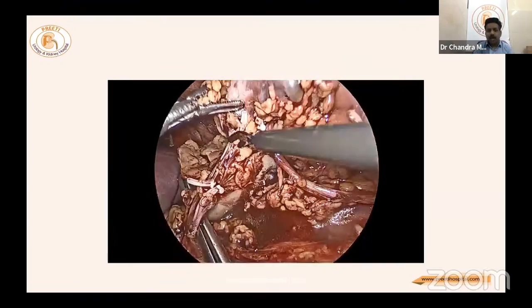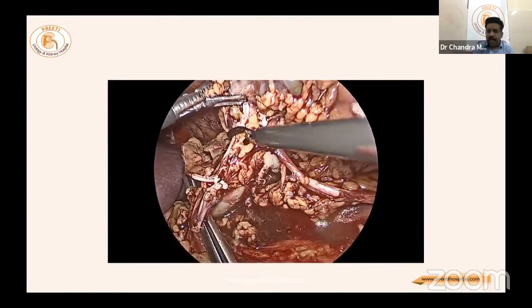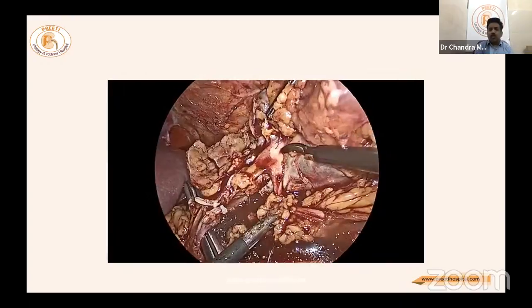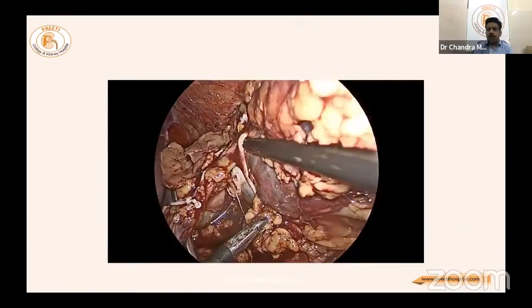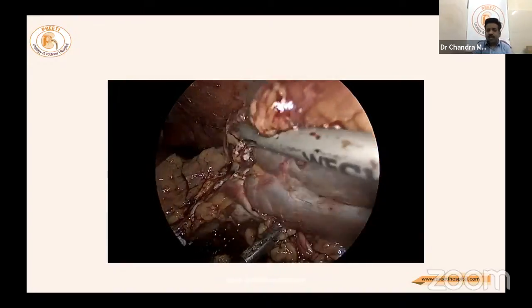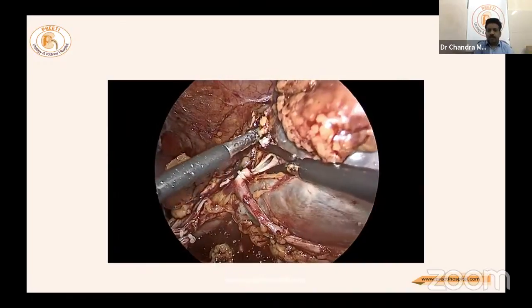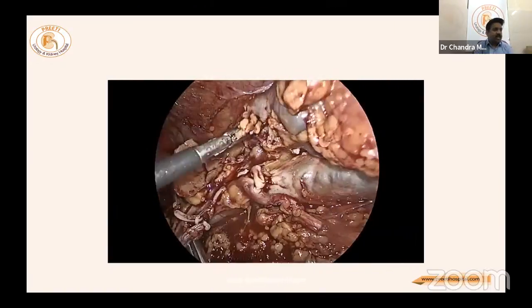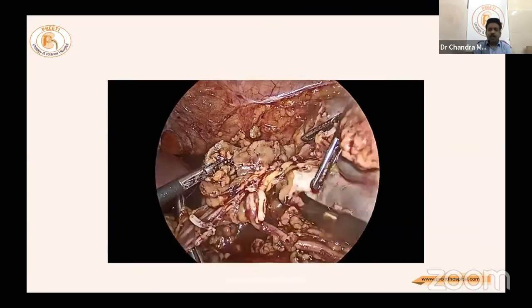From all sides, care must be taken not to cut the ureter. In this benign condition, where the patient expects nephrons to be saved, stay close to the parenchyma. The lower pole infundibulum is visible and is clipped, but as it is large, suturing is required later. After cutting posteriorly, the remainder is removed — the ureter is divided, and the rest of the kidney is separated.